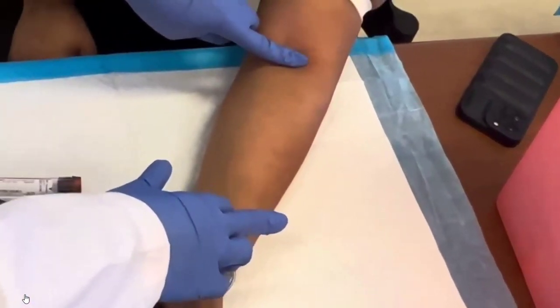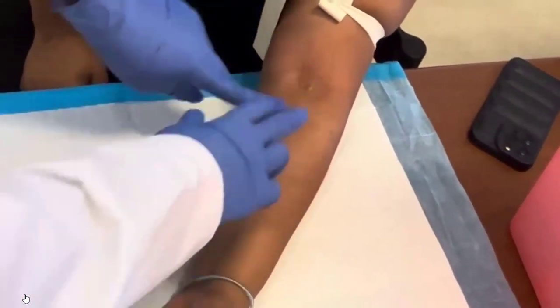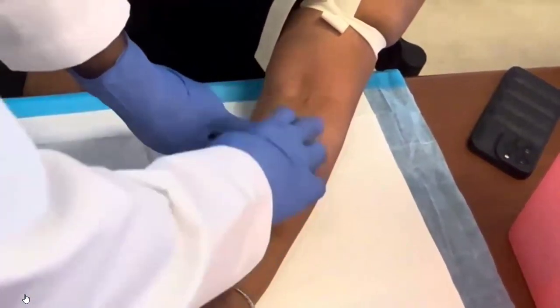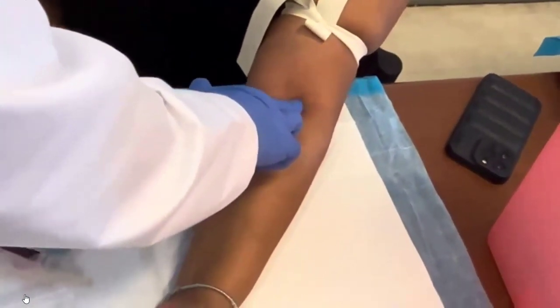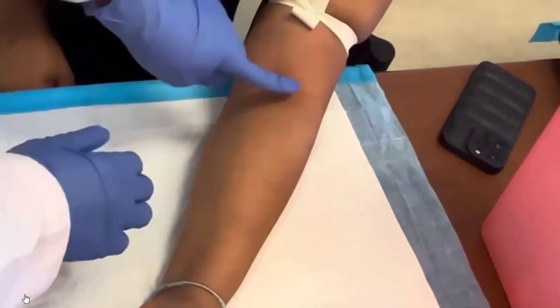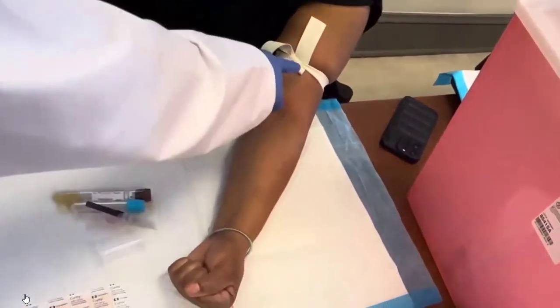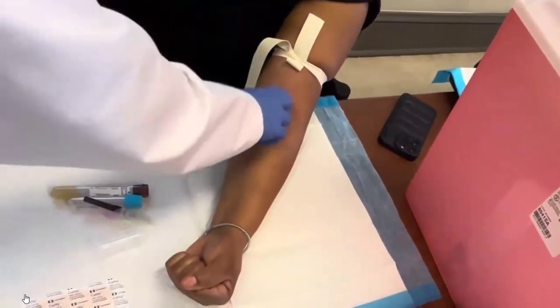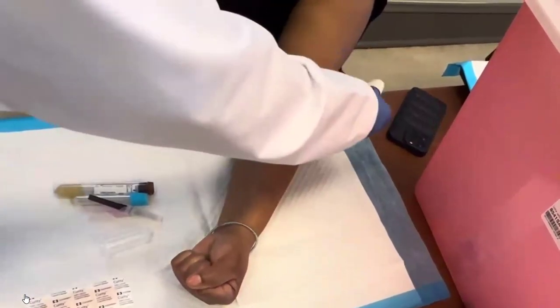So I'm going to feel that there. And the way we feel for a vein, we want to palpate, right? We're not going to be feeling like this. We're going to palpate just like that. And the vein is actually spongy. It kind of bounces right back at you. All right, so once I find her vein, because this tourniquet should not be on for more than a minute, we're going to go ahead and release it, or as we say, pop the tourniquet.